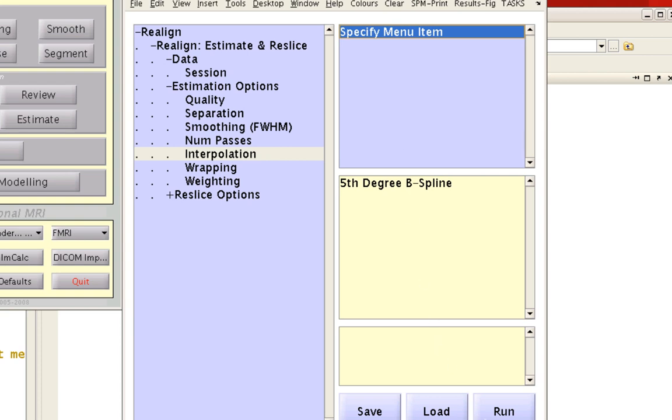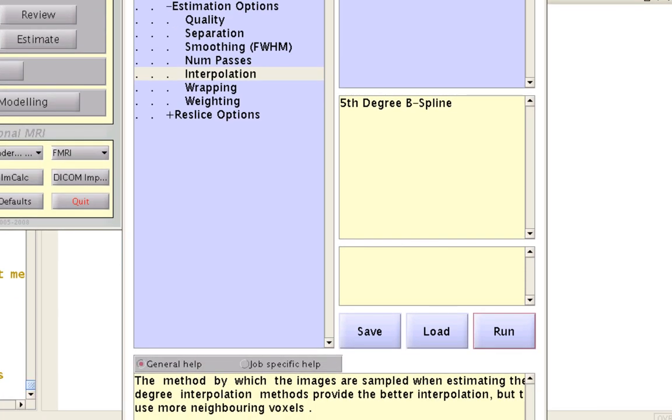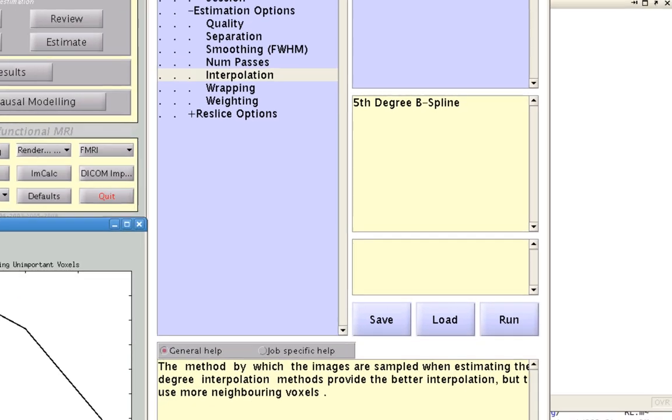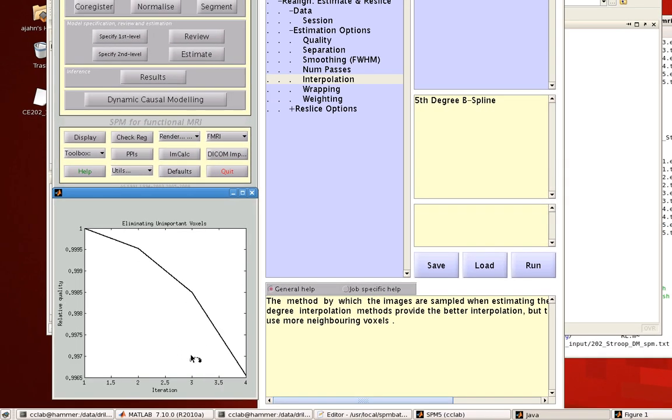After you're done with all that, click Run and it will execute the Realign and Reslice process. You can see the progress in the Progress window.